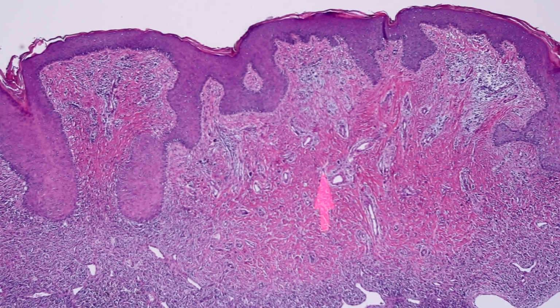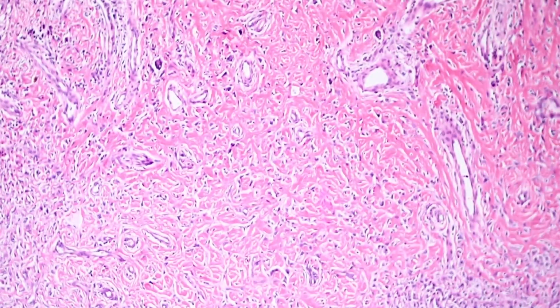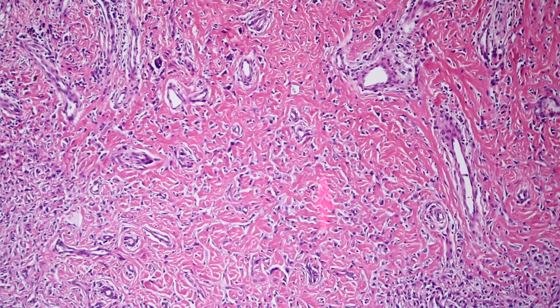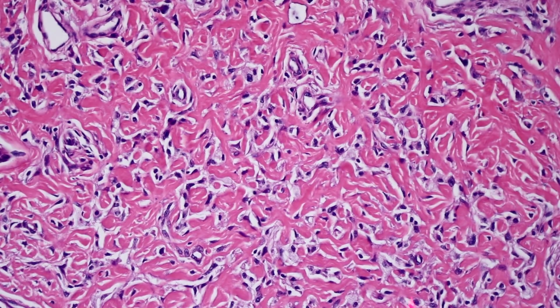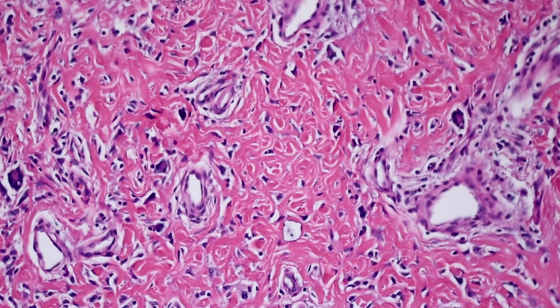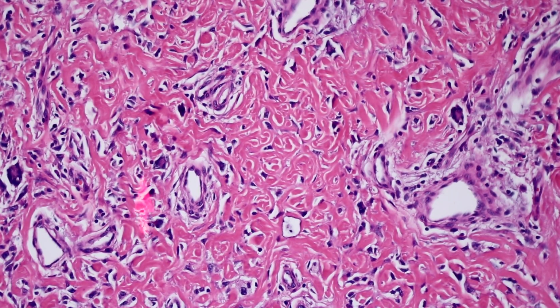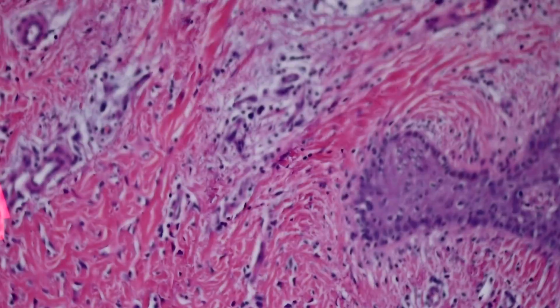Up here, the lesion's a lot less cellular and more sclerotic. And if you look in here, this looks quite similar to that atrophic or sclerotic pattern of dermatofibromas that we often see more commonly than this big hypercellular deep form. We see dense sclerotic collagen and spindled and stellate, triangle-shaped cells wrapping around the collagen there. So that's a real nice example, again, at the periphery of these big cellular lesions. If you look around at the periphery, you'll usually see areas that look much more like conventional dermatofibroma. And here, giant cell, giant cell, giant cell. Giant cell is a very common finding.